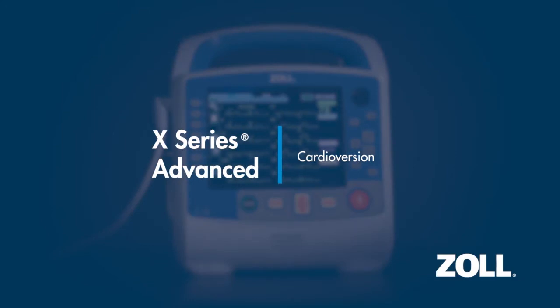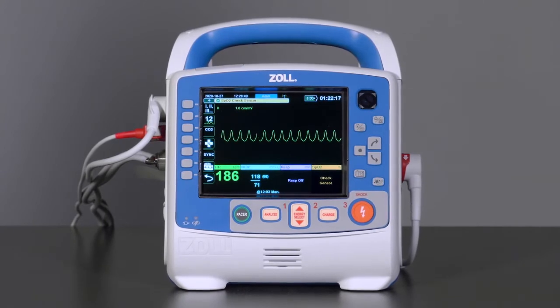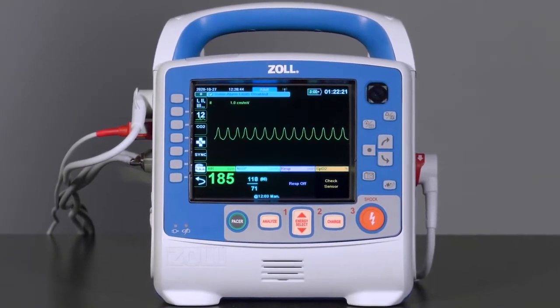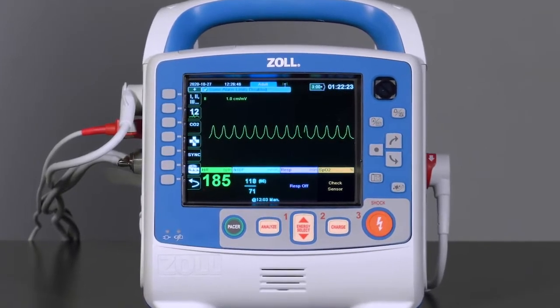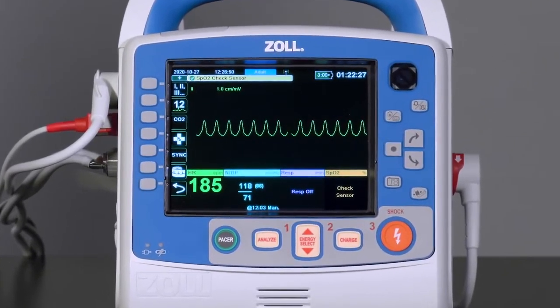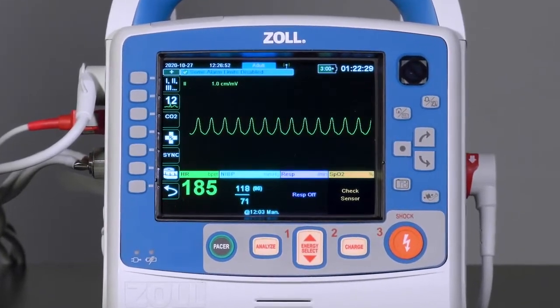Cardioversion. Certain arrhythmias, such as ventricular tachycardia with pulse, atrial fibrillation, and atrial flutter, require synchronized cardioversion, where a shock is timed to coincide with the R-wave of an ECG complex.